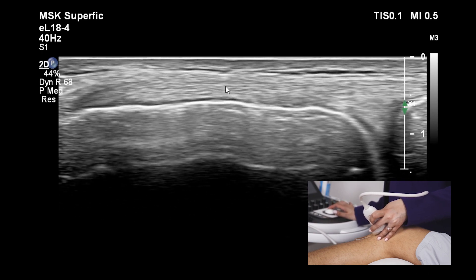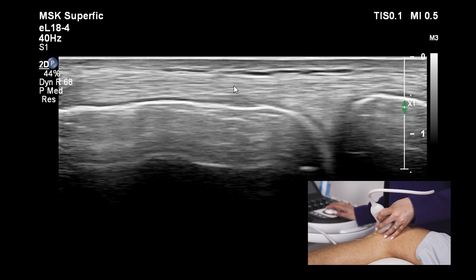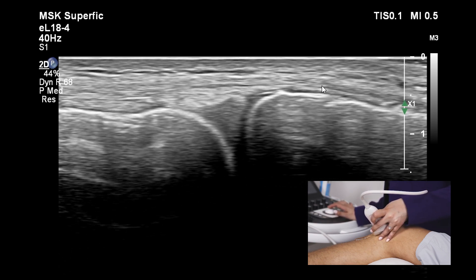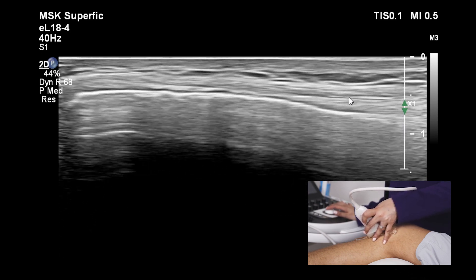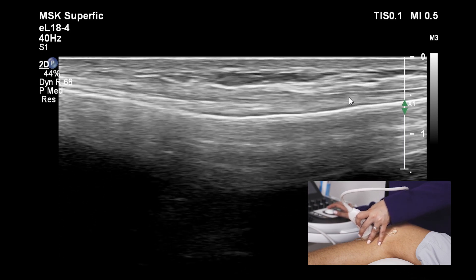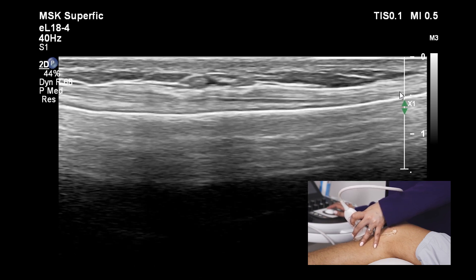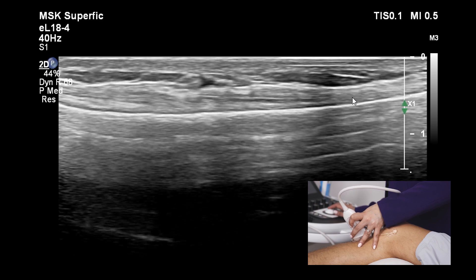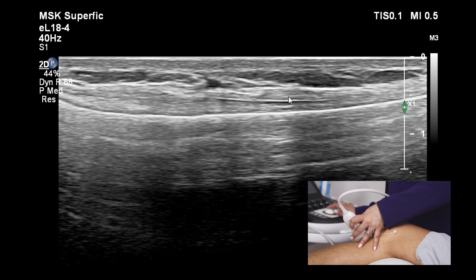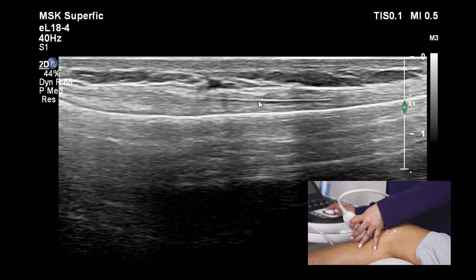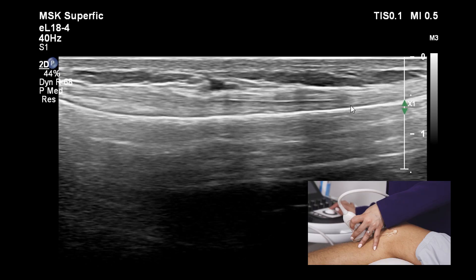Let's follow this ligament proximally as it attaches on the femur, and then distally as it overlies the tibia and extends further. This is where we see the attachment of MCL fibers on the tibial surface. Note that this is the area where the pes anserine tendons are crossing just above the medial collateral ligament — this is the distal portion of the MCL.